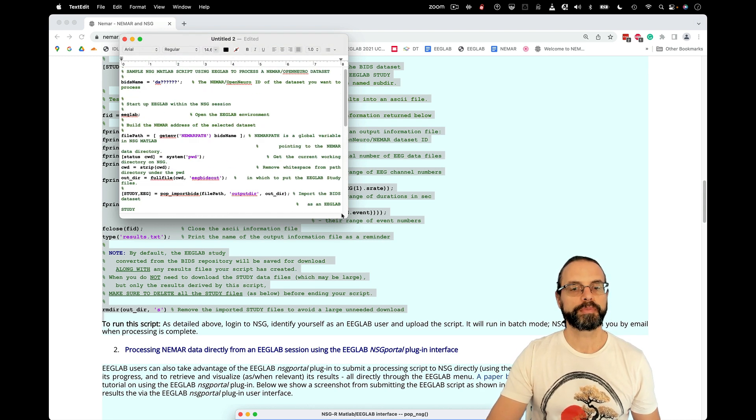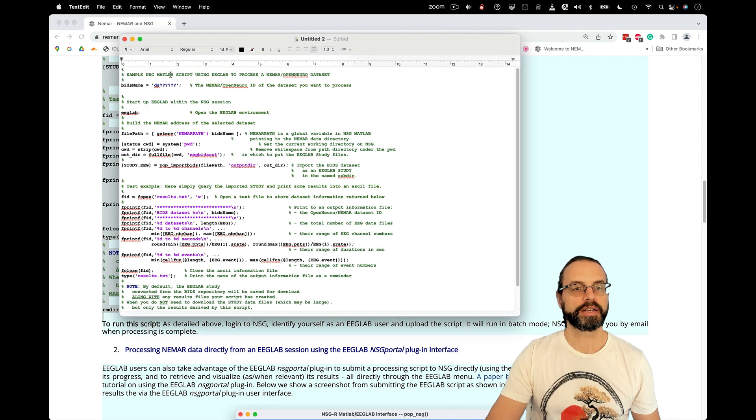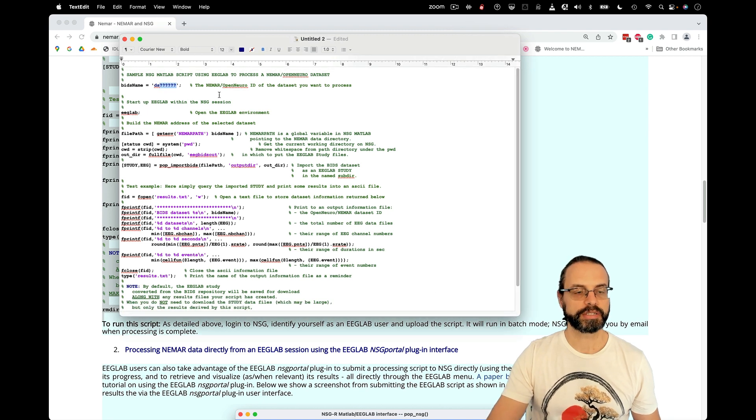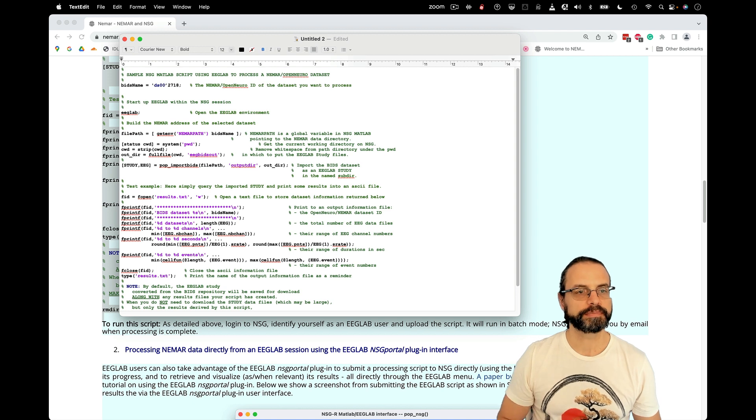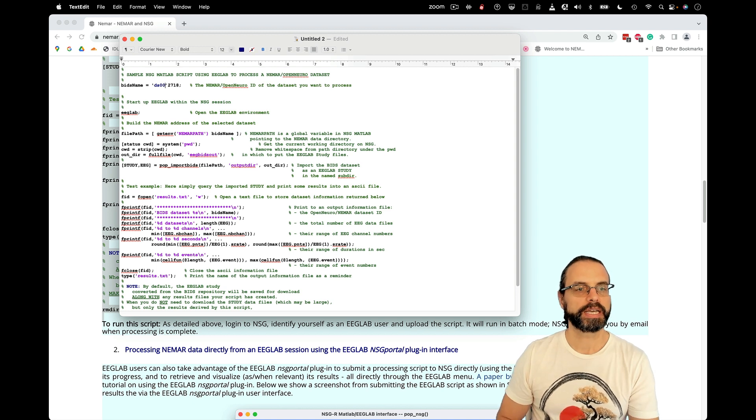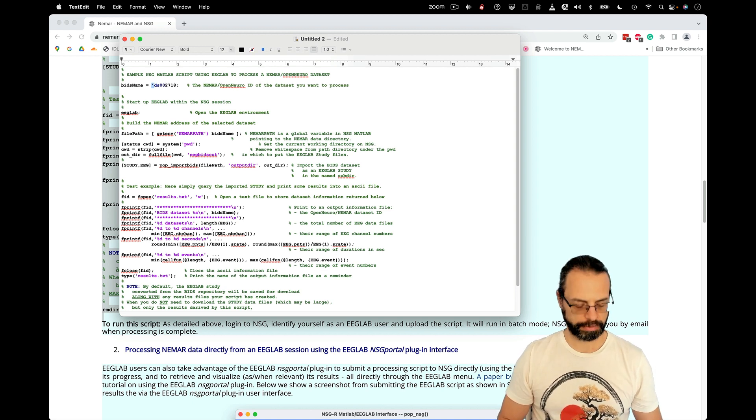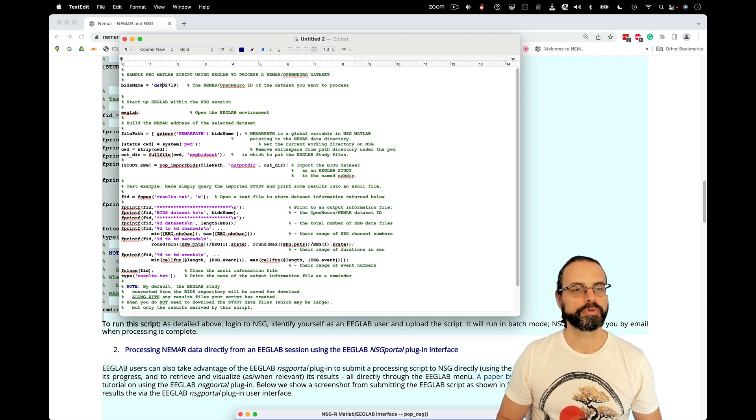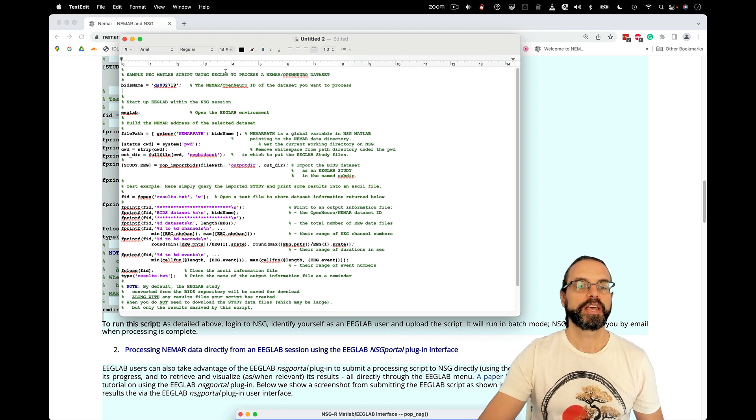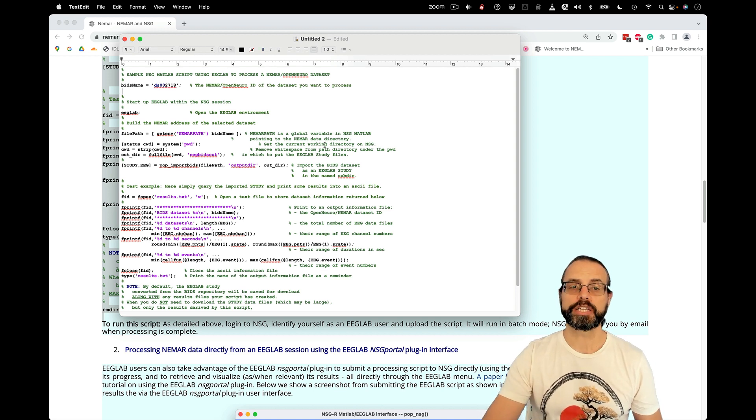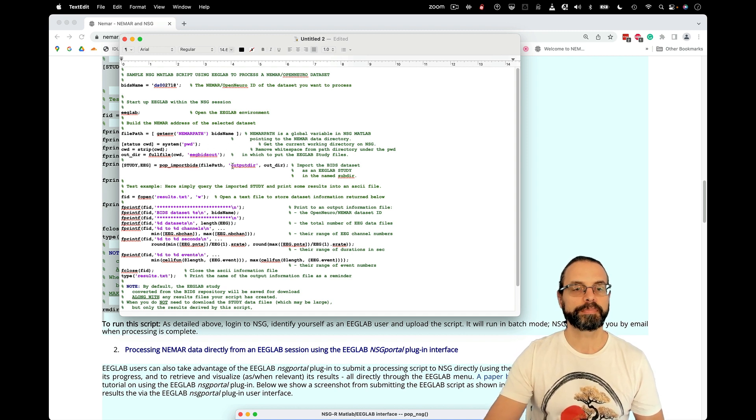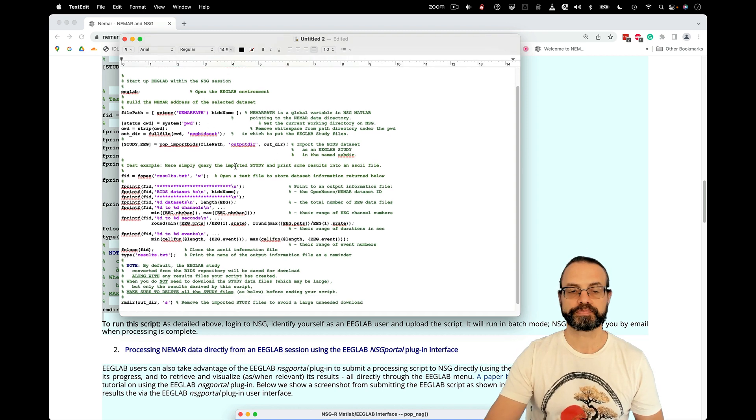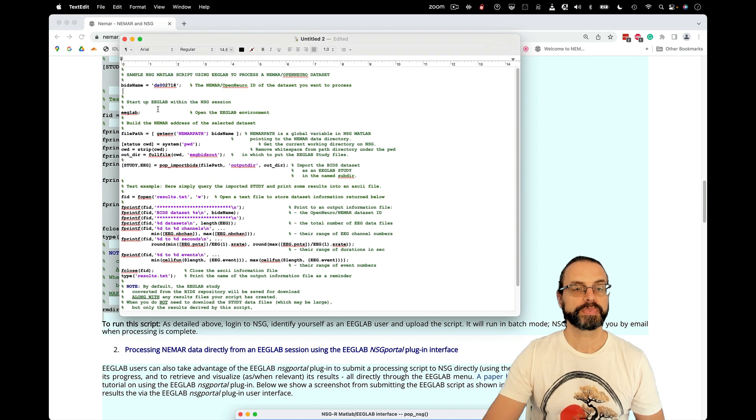You remember that dataset number? This is where we have to enter it, DS002718. And we have to put back the quote where it belongs here. And now we're going to save this dataset. When you copy and paste on your own computer, sometimes there are spurious characters, so the script might not run. So you have to be careful about that.